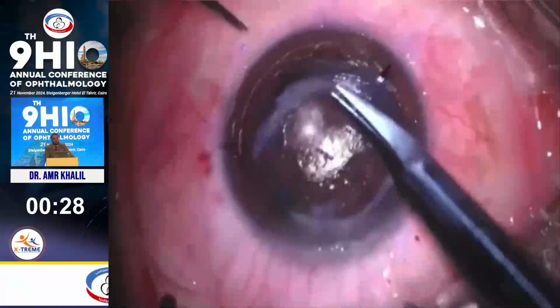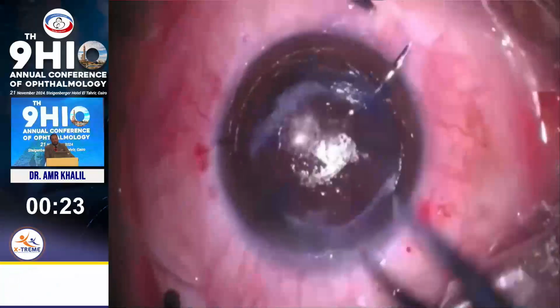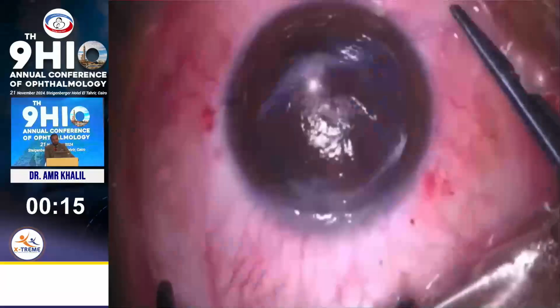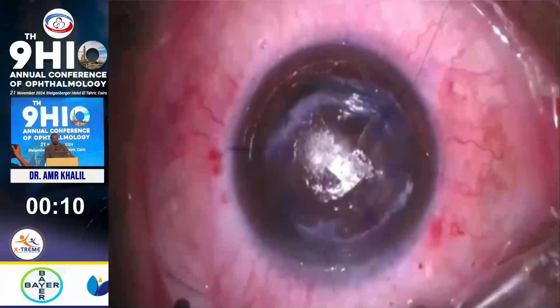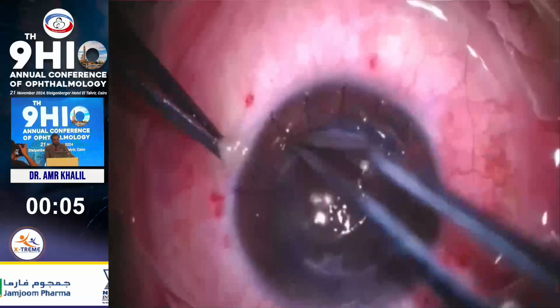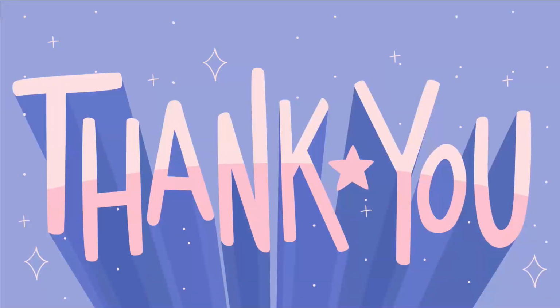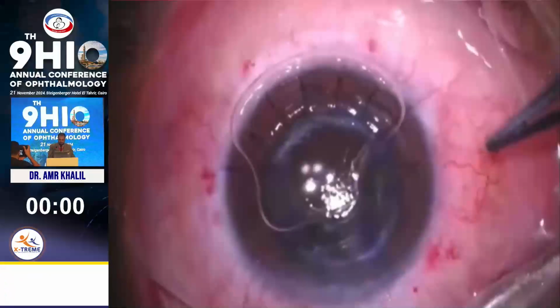When you decide to place sutures in such cases, you may like to tighten the sutures more than usual, also to not allow any recurrence postoperatively, and to close any track for the epithelial cells to migrate again to the interface. Now burying the knots. Two minutes, please. And putting on the contact lens.